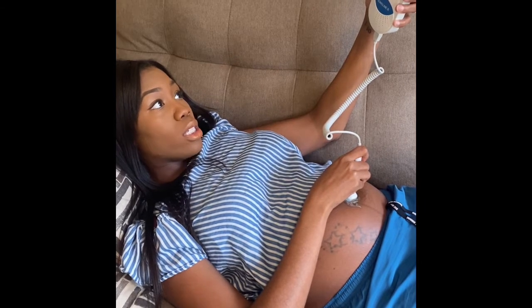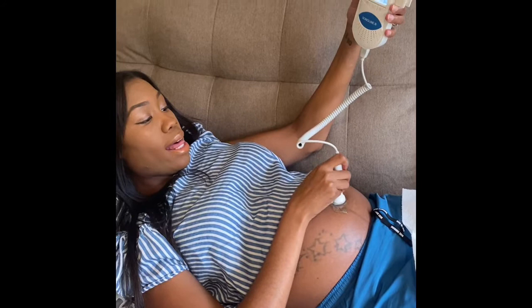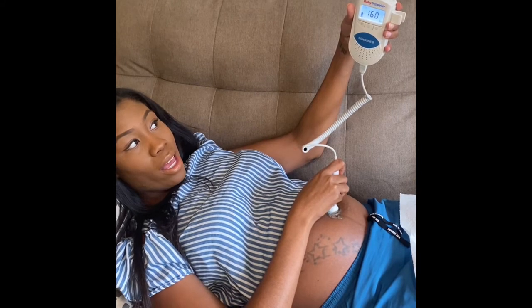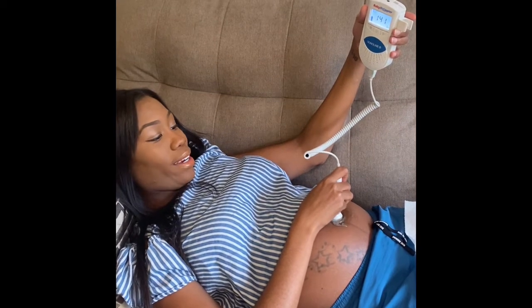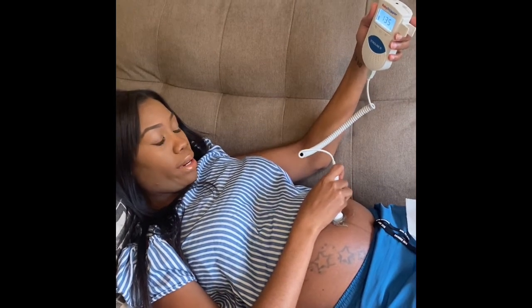The number will continue to rise until it gets steady, and then it'll stop. I'm 22 weeks, so it should be around 150, but you see the number is kind of all over the place, maybe because I'm talking, and I'm moving it. That's why I really don't recommend this, because it's hard to get anything accurate. But you could clearly hear a strong heartbeat. It's at 160 right now. And 160, 155, that's where we want him to be. So he's doing just fine. I think it's because I'm talking that the number is all over the place. I never talk like this.